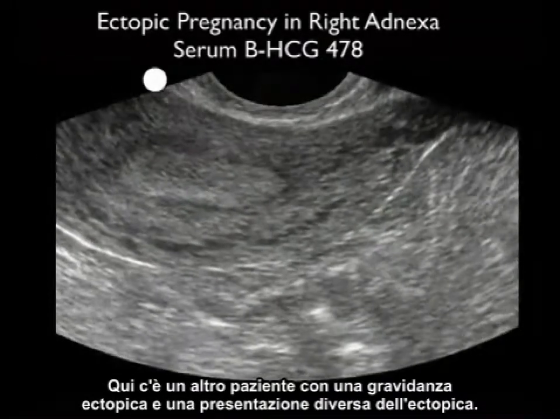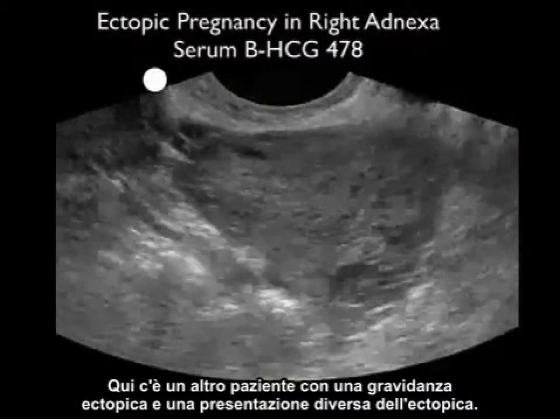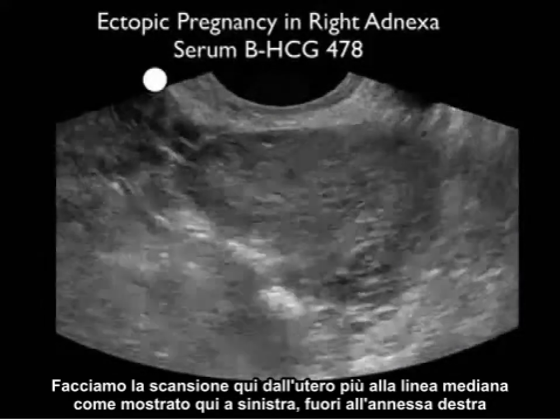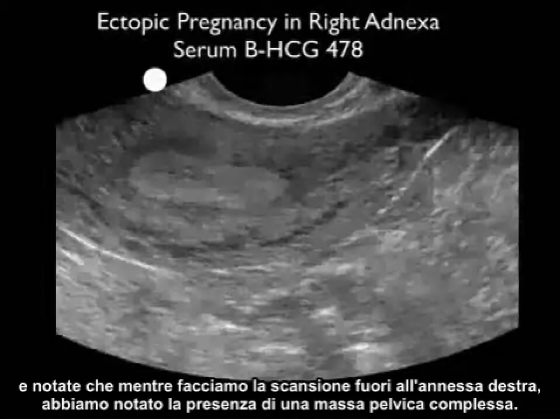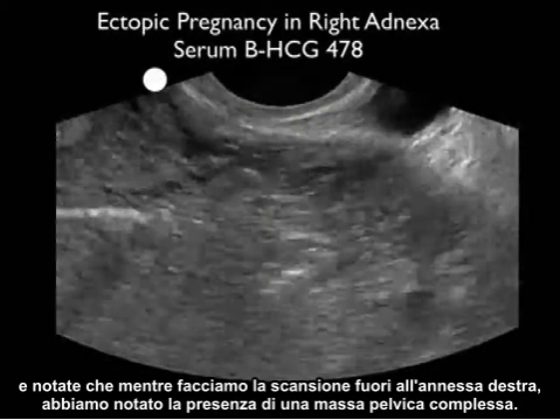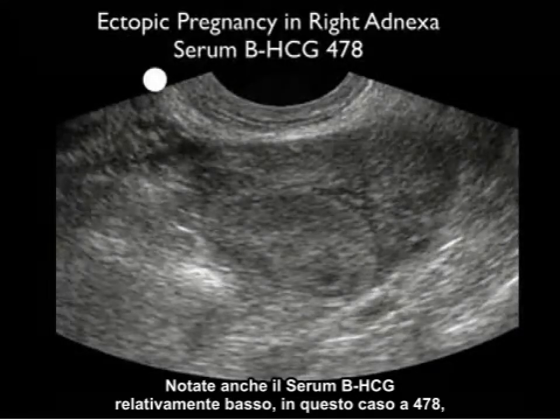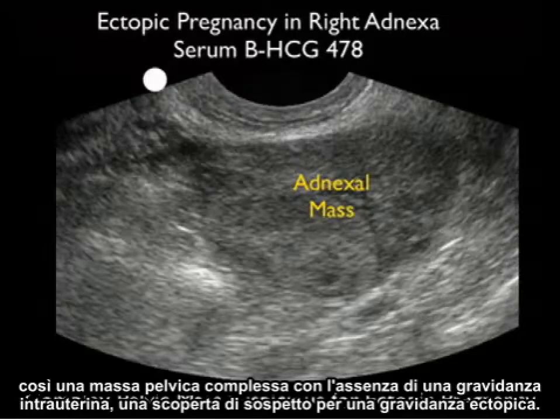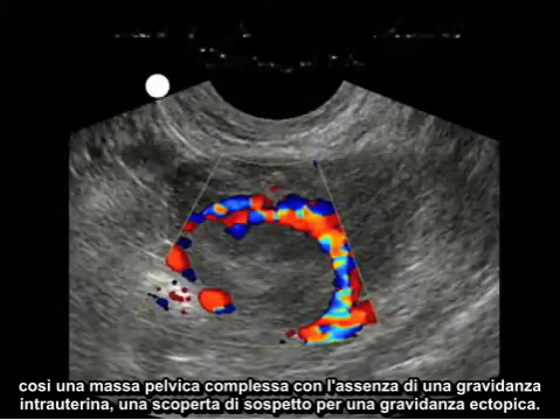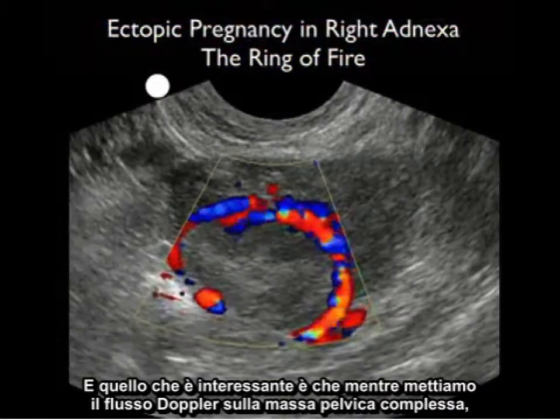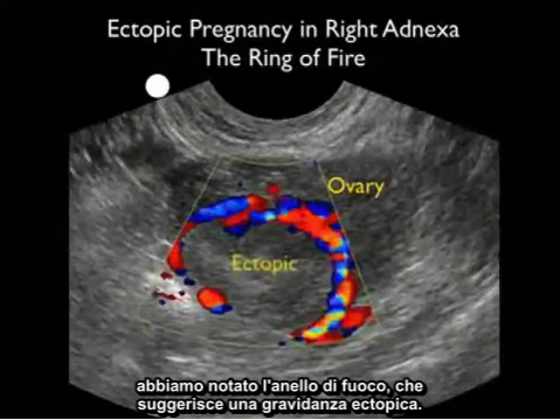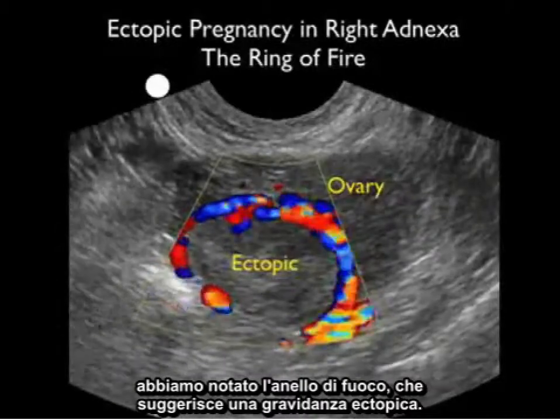Here's another patient with a different presentation of ectopic pregnancy. We're scanning from the more midline uterus out to the right adnexa, where we notice the presence of a complex pelvic mass. Notice also the relatively low serum beta-HCG in this case at 478. A complex pelvic mass with an absence of an intrauterine pregnancy is very suspicious for an ectopic pregnancy. As we put Doppler flow on that complex pelvic mass, we notice the presence of the ring of fire, very suggestive of an ectopic pregnancy.